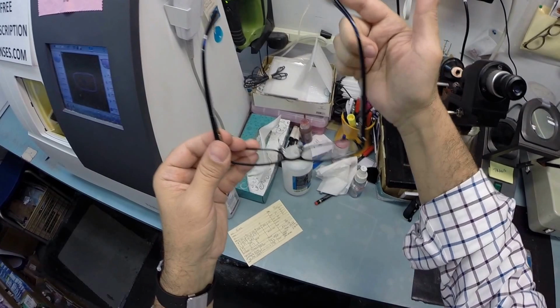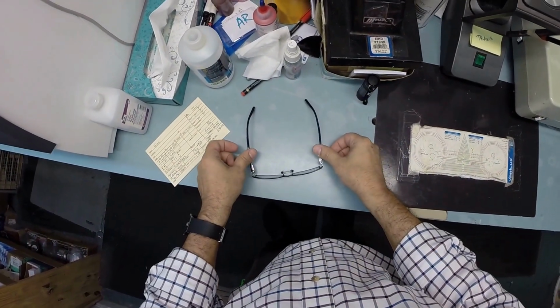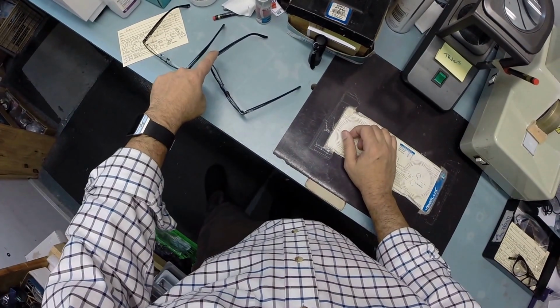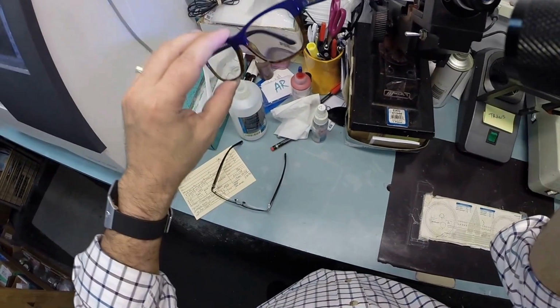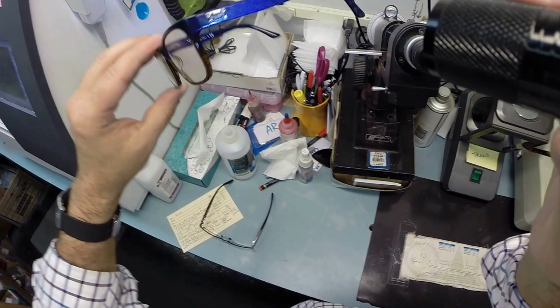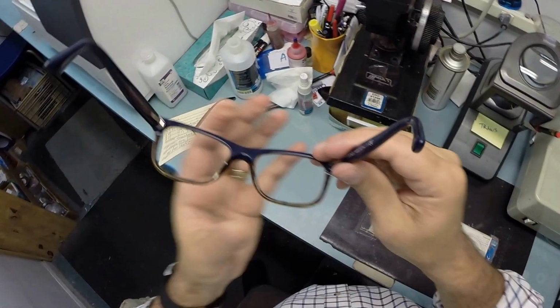The 3 points are 1, 2, and the bottom of the frame being 3. I set them on the counter and press down. There is no wobble. When I say wobble, I'm part of that 80%. When I take mine off and I press down, they wobble on the counter, but they sit level on me. For those of you keeping score at home, I'm wearing the Versace 3199 in color 5118, which is the blue and Havana. Havana is just a fancy word for tortoise.